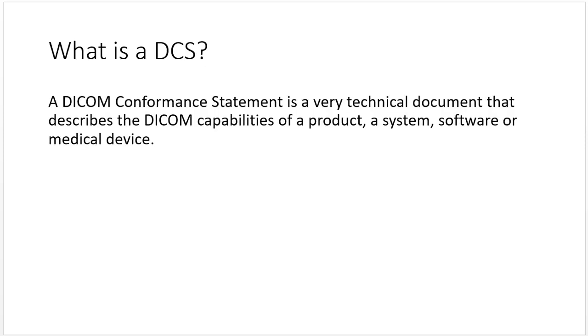What is a DCS? A DICOM conformance statement is a very technical document that describes the DICOM capabilities of a product, system, software, or medical device. The DICOM conformance statement is typically 300 pages long and full of complex DICOM terms and jargon.